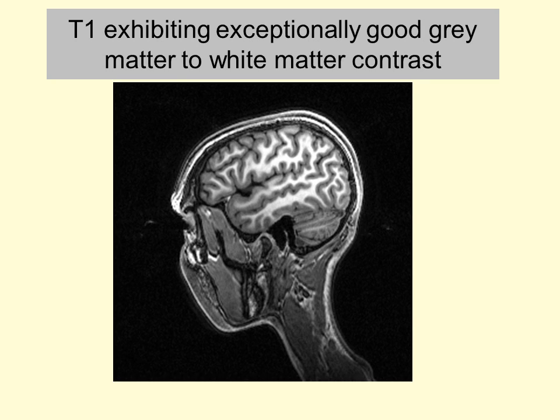The disadvantage of this is it takes 20 minutes to obtain this image versus 5 minutes for the standard MP-RAGE, but if your research interest requires you to segment the brain into separate white and grey matter images, perhaps because you'd then like to computationally flatten the cortical sheet, then this is the type of image that you really need in order to make that process work well.